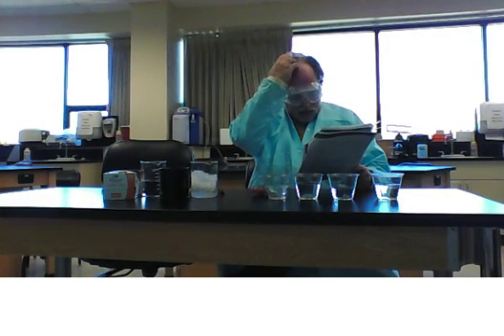And then the next thing you're going to do is move on to temperature, okay? You're going to place a thermometer in a plastic bag or a piece of plastic wrap and place the thermometer under your tongue for about a minute and record the temperature in data table 4 of your lab report assistant. Okay, so relatively straightforward. Same thermometer you've been using for the other trials. The plastic bag is designed again to keep you from putting something nasty in your mouth. Okay, so it's a nice clean plastic bag.